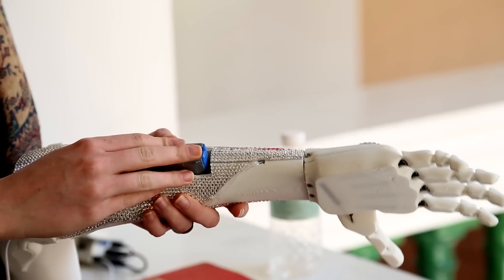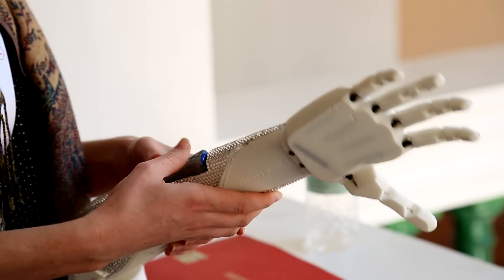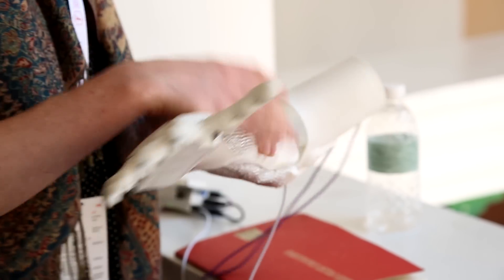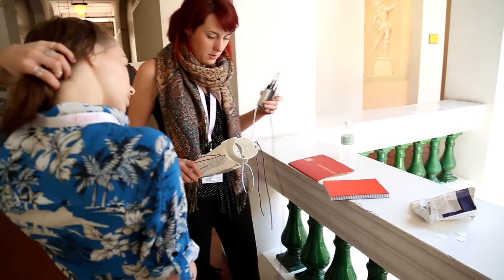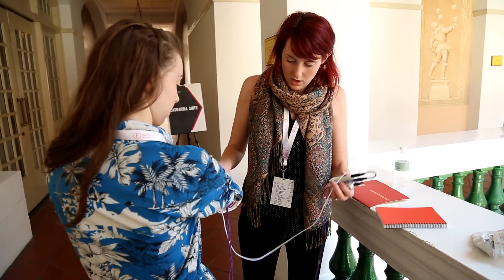We met with Grace and 3D scanned her residual limbs — her foreshortened forearm. Grace was born with a foreshortened forearm. We 3D scan her limb, which makes a 3D mesh. Then we do a little bit of tidying up on that, make a 3D model, and 3D print it. We 3D printed this whole socket to fit Grace in just two days.